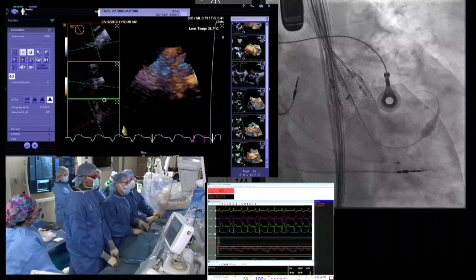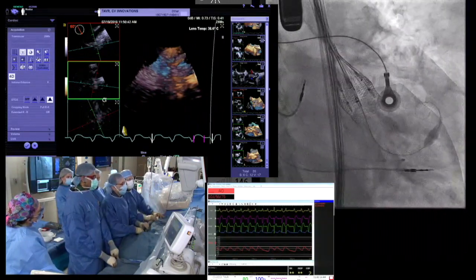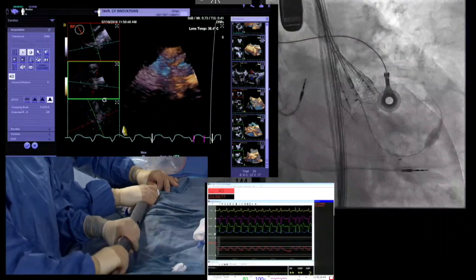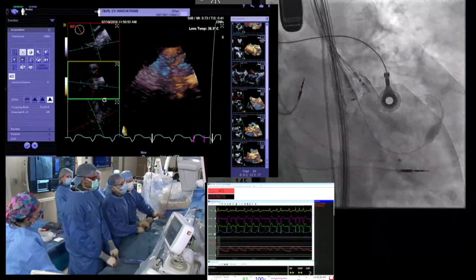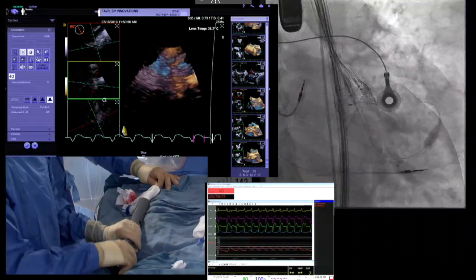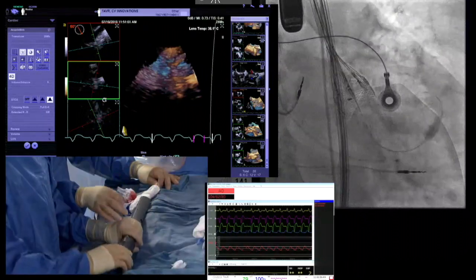Yeah. Okay. So now you see our posts and our buckle, and we're going to start moving a little bit more counterclockwise with our handle. And those are coming together, and we're going to look for those to lock. Now, we do something where, as we're beginning to lock this, if there's a lot of calcium, sometimes you'll get some early grinding of the device.